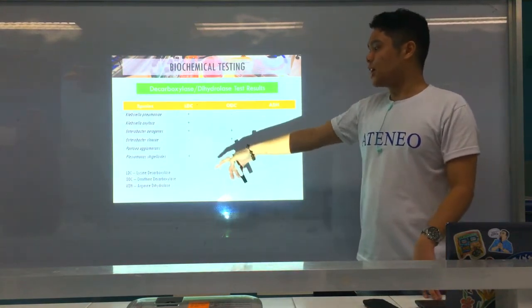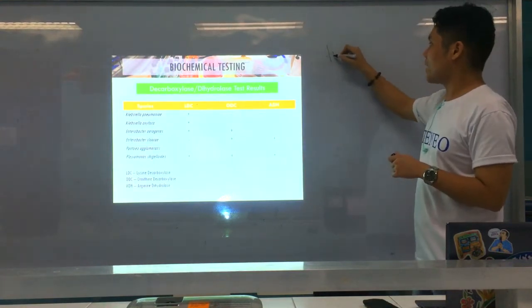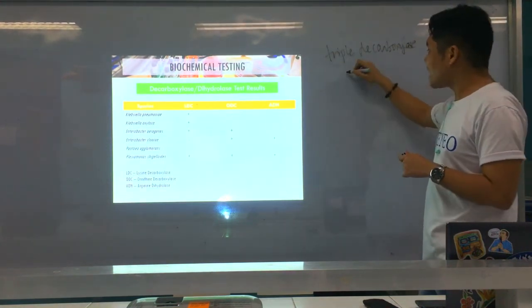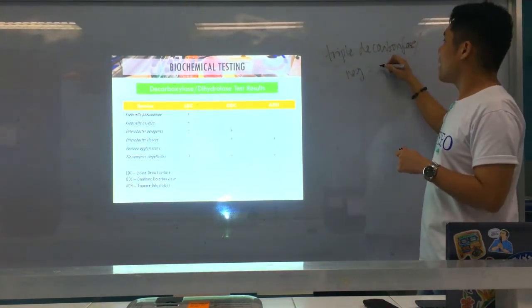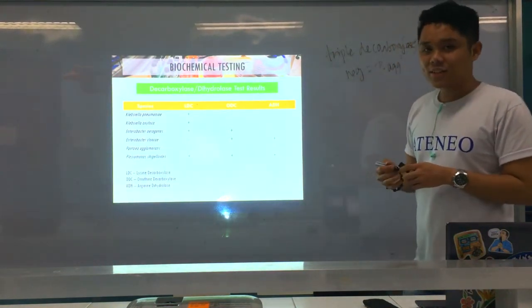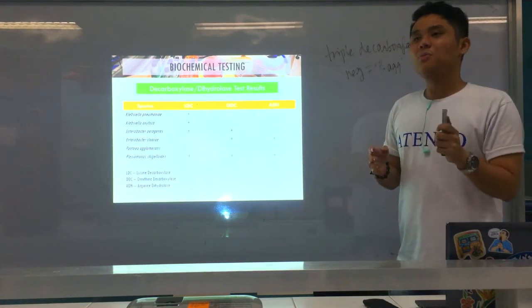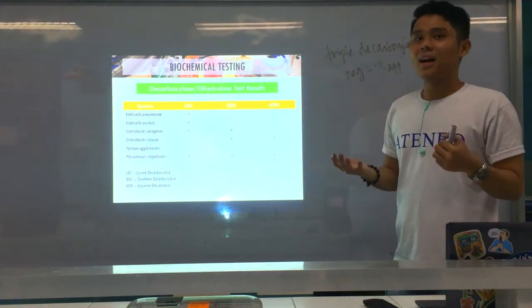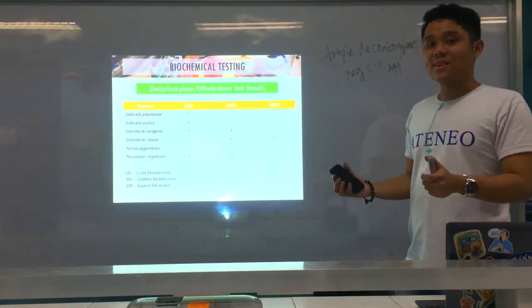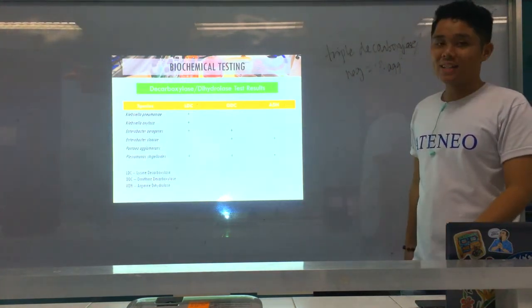Okay? Alright. Now, for Pantoea agglomerans, very characteristic po niya, negative tanan. That's why if i-ask mo triple decarboxylase, okay? Decarboxylase negative or dihydrolase negative, it's Pantoea agglomerans. Okay? But kinsa ng triple decarboxylase or dihydrolase positive, it's Plesiomonas shigelloides. Ayan, wala ni gawa sa mong boards, but I was like na amazed ko pag nakabalo ko sa pag-study, sa pag-review na ako. Alright? So again, triple decarboxylase negative, it's your Pantoea agglomerans. Triple decarboxylase positive, it's your Plesiomonas shigelloides.